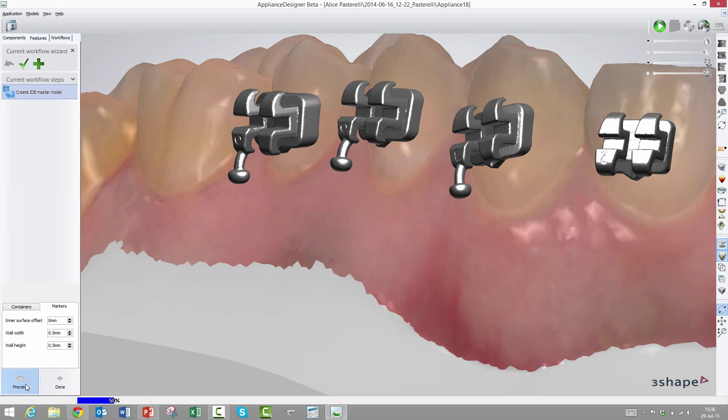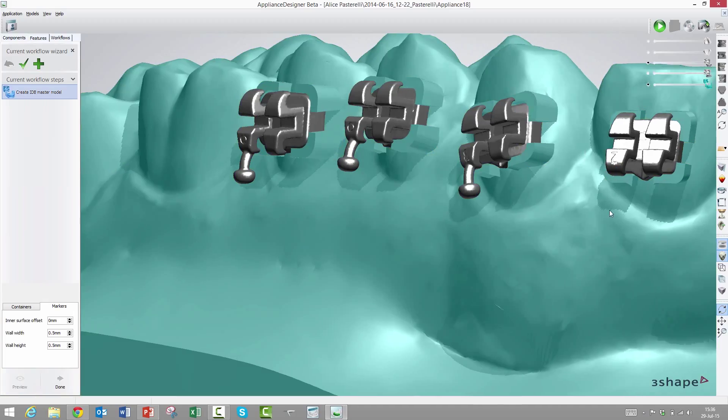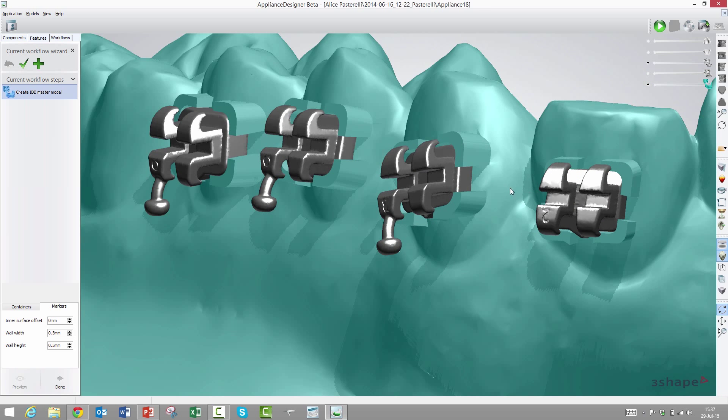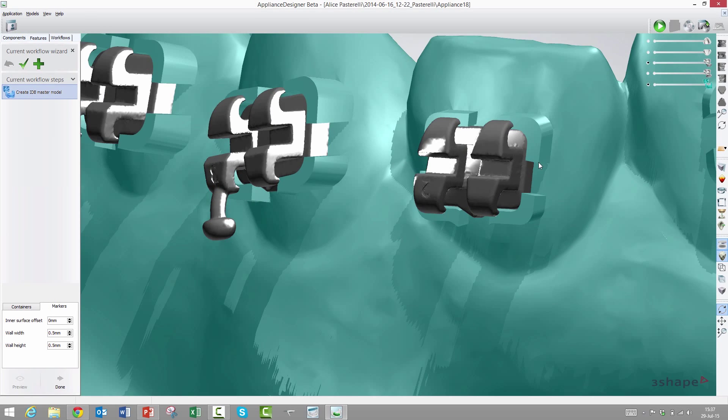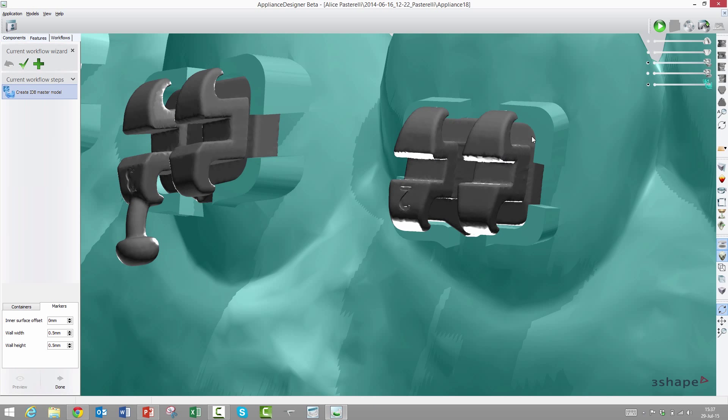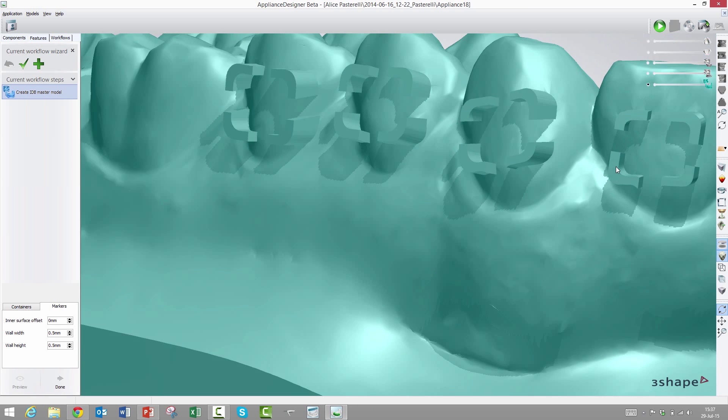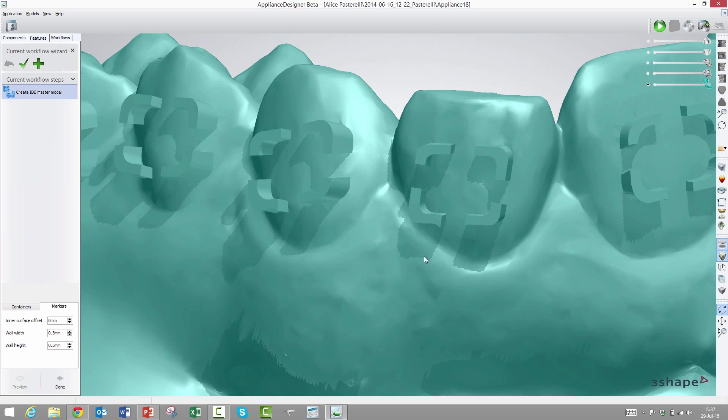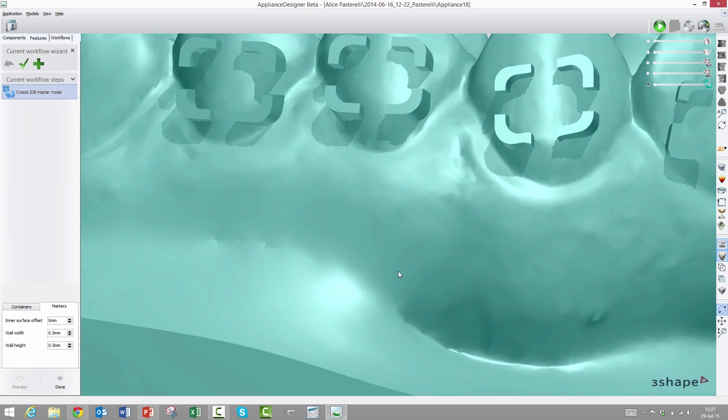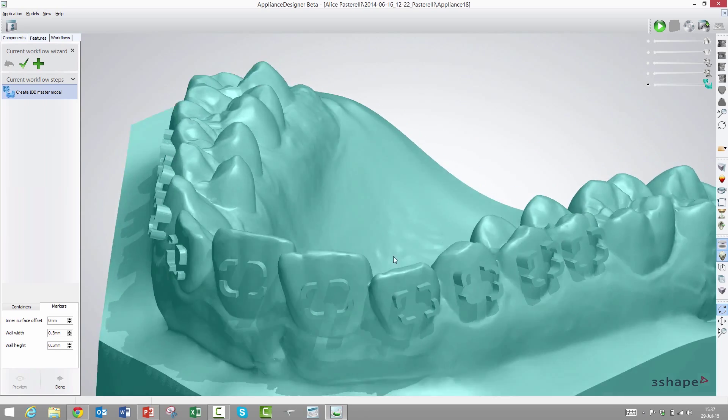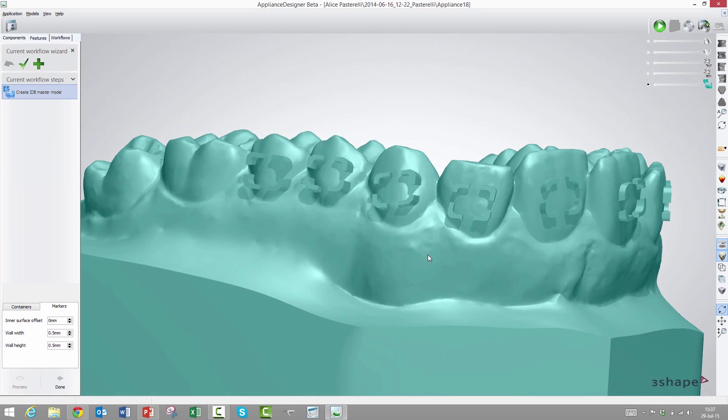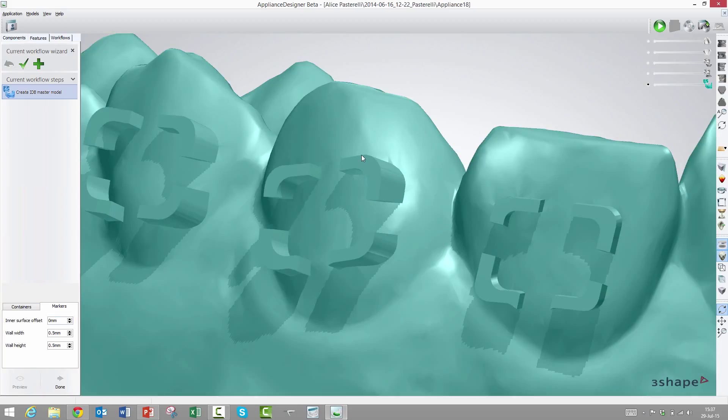I'll start the generation while we talk about the parameters. The first parameter is called inner surface offset. What that does is it on purpose either makes the footprint of the bracket too big or too small. If we have some friction issues, we could circumvent them by making this wall too small. It's done computing. This is fully automatic depending on what bracket library you have chosen.